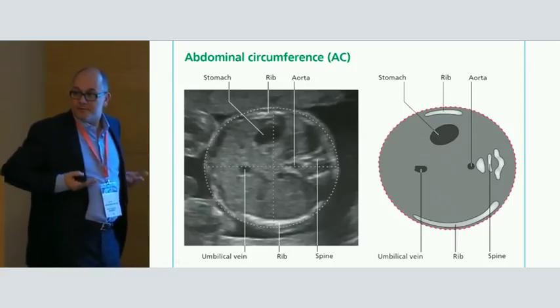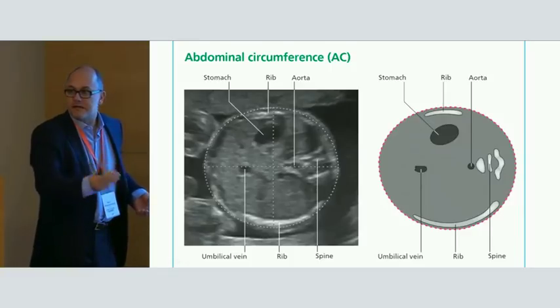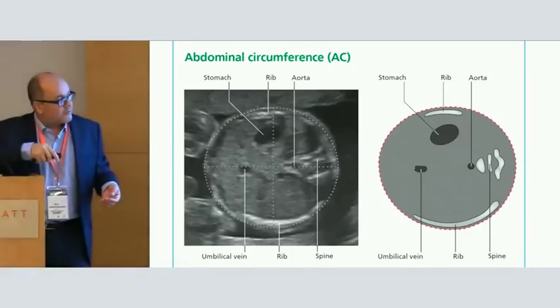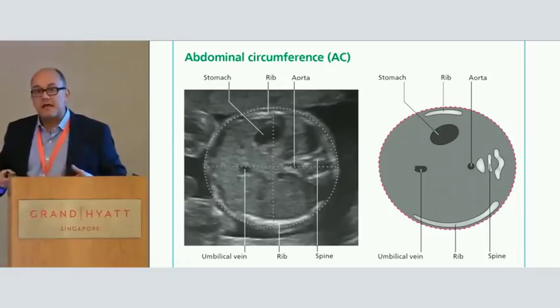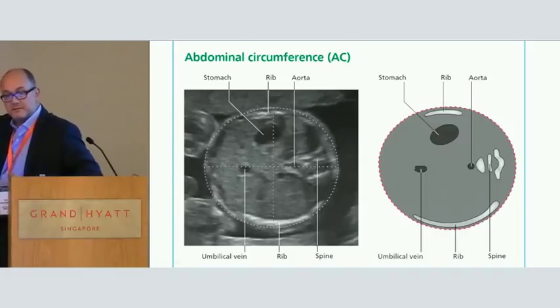As I move up, that little black spot will go backwards and upwards towards the heart. So by having it a third of the way along means that I'm in the correct plane. Does that make sense? So this is how it helps us, because that vessel runs diagonally like this from the cord insertion to the heart.